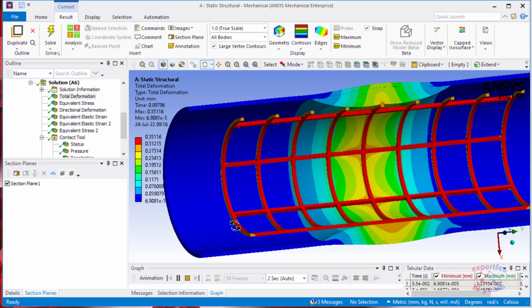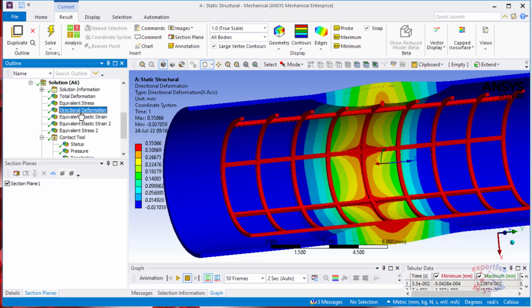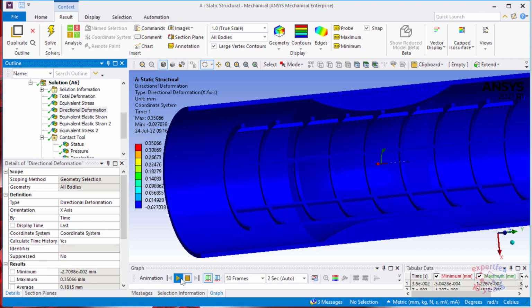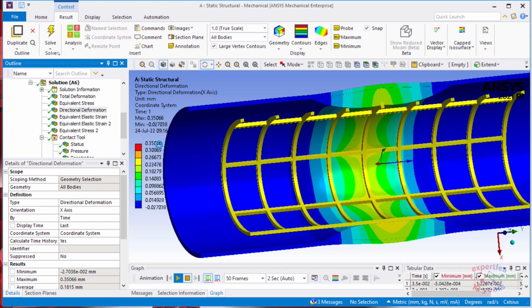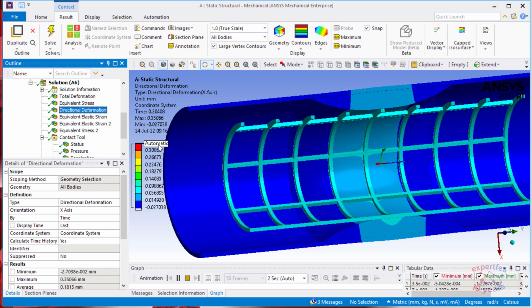If we want to see the correct radial displacement, we need to access the directional deformation that we created about the coordinate system. It's pretty similar to the other one. It's logical, because we apply 0.35, so it's normal for this value to be my maximum, 0.35. We just wanted to be sure.